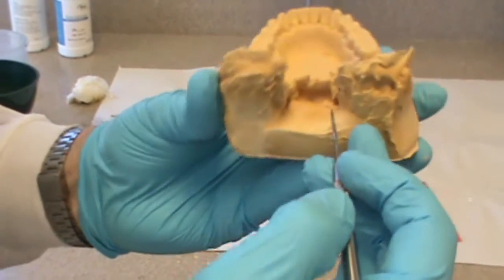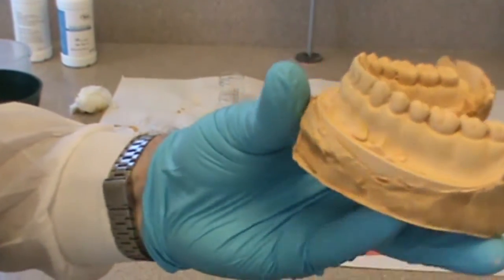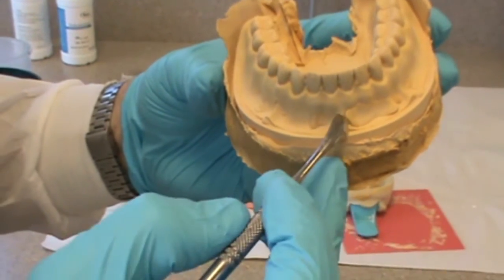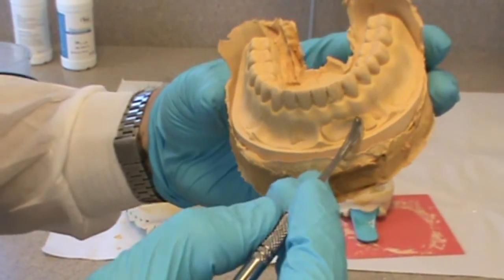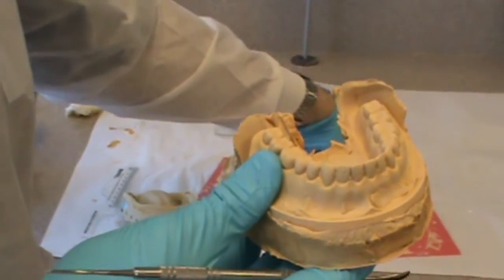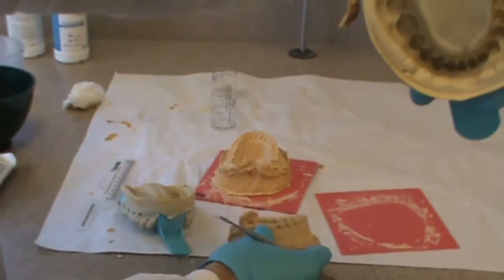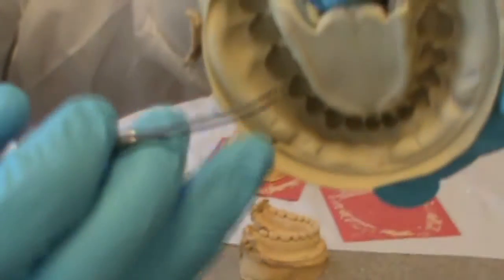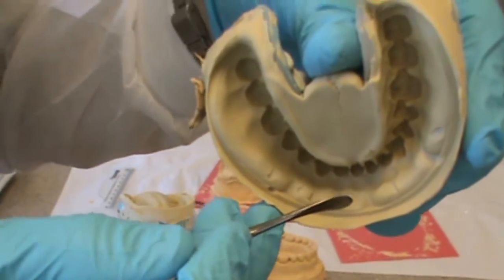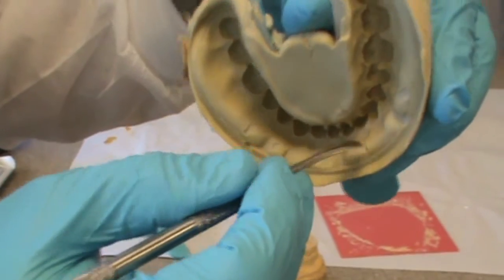Because this impression was done on a typodont, there are some features that don't exist on real patients. For example, this already has a land area built in and a flat lingual surface. A real patient won't have that — you'll have to actually build that into your cast. So it's not entirely realistic, but it's pretty close. You can see these large air bubbles in the vestibule that we talked about previously.